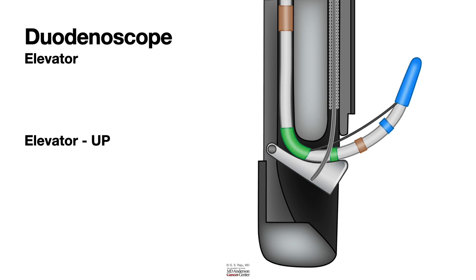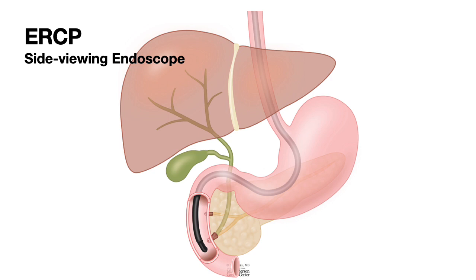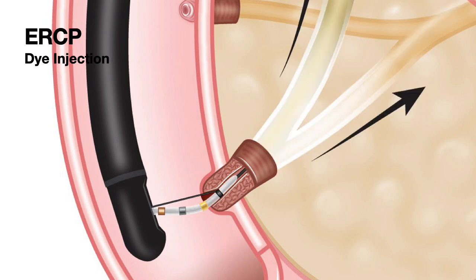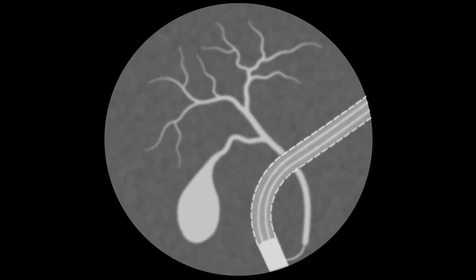We do it in the fluoroscopy room. We use a duodenoscope, and let us go through the steps again. So here is a side viewing endoscope in the descending duodenum facing the ampulla, and with the help of the elevator you cannulate the bile duct, and with the wire you cannulate deep and inject dye and monitor the dye movement in the bile duct and the pancreatic duct using fluoroscopy.